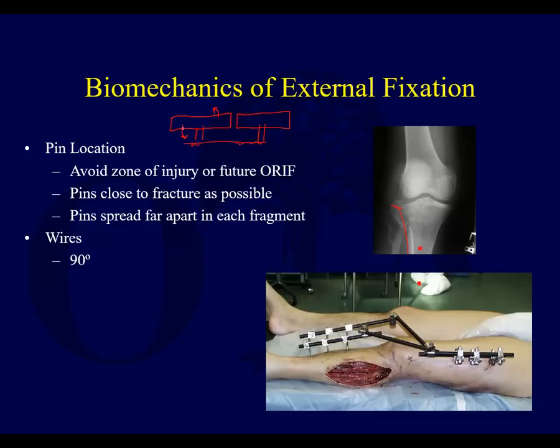Contrast that to putting your pin here and here — well spread in one fragment — and then here and here in the other. That's going to be much more stable. That segment, being fixed here and here, is not going anywhere — it's not acting like one pin.